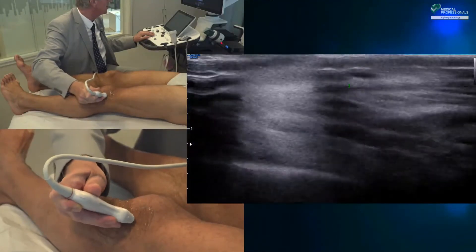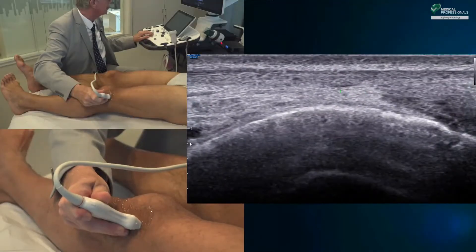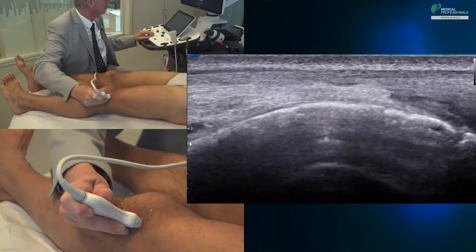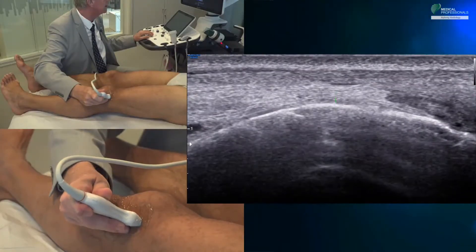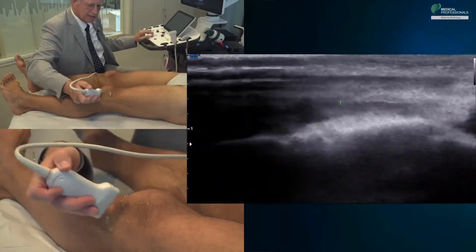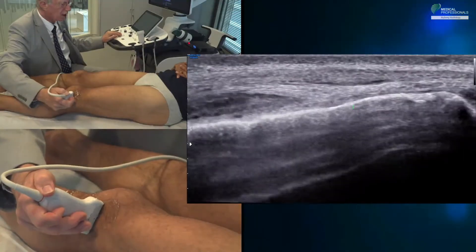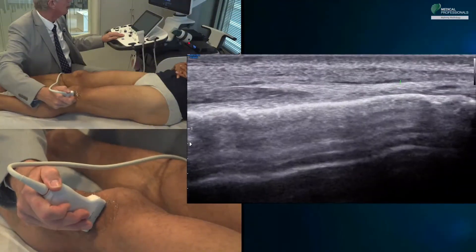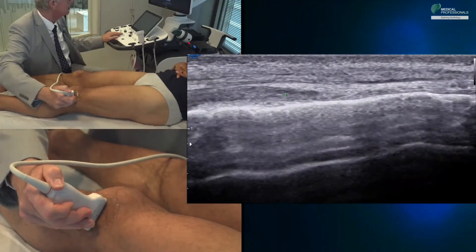We verify there is no significant swelling at this level, then we go up slowly to visualize the band next to the femoral condyle. We know that in this place, bursitis — the famous iliotibial band syndrome — can develop. Here we see that there is absolutely no hypoechoic rearrangement between the band and the femoral condyle. If there is one, it is necessary to perform a dynamic maneuver: the translation of the patella. When analyzing the iliotibial band at the femoral condyle, the retro-quadriceps recess is very close, so hypoechoic swelling or fluid distension seen under the band can correspond to the lateral part of this cul-de-sac.